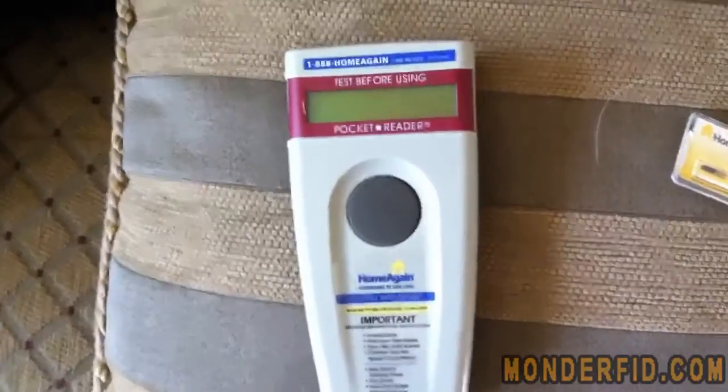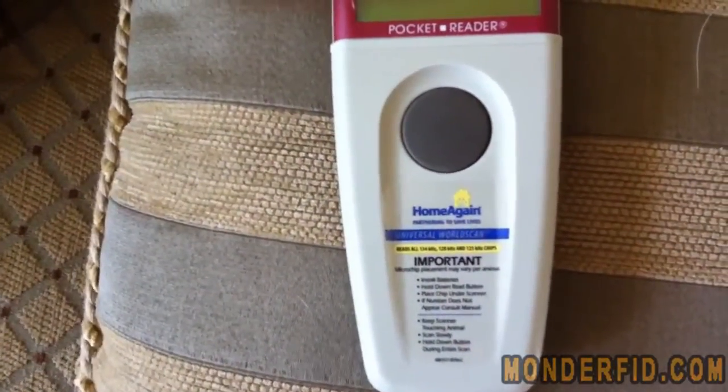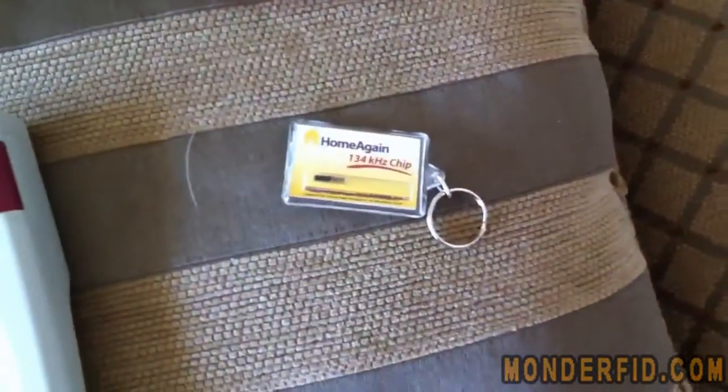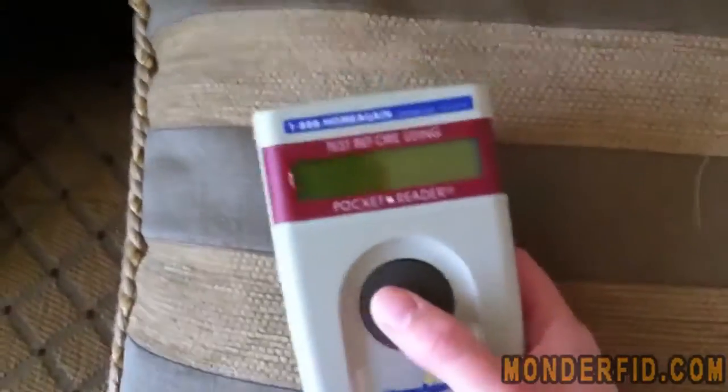We have a HomeAgain scanner. It reads 134, 128, and 125 kHz chips. It came with a test chip. It's just got the one button — it's pretty simple.